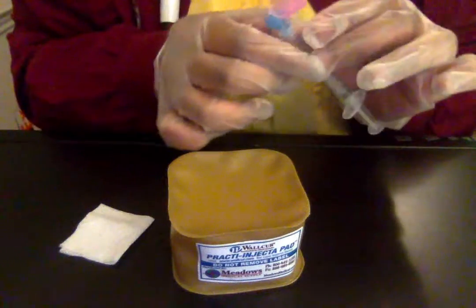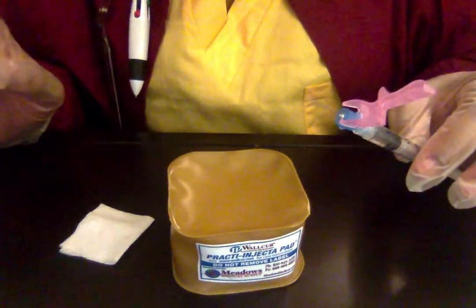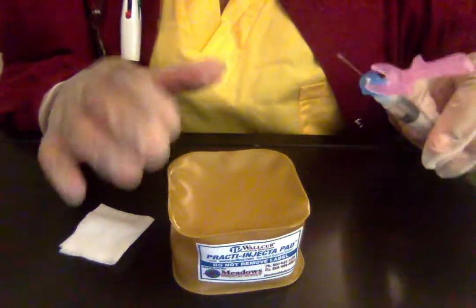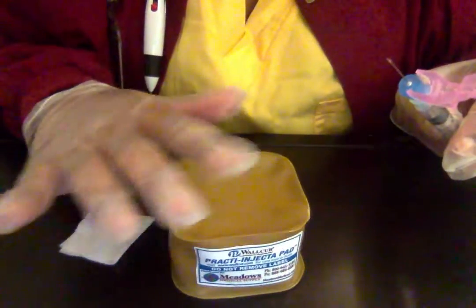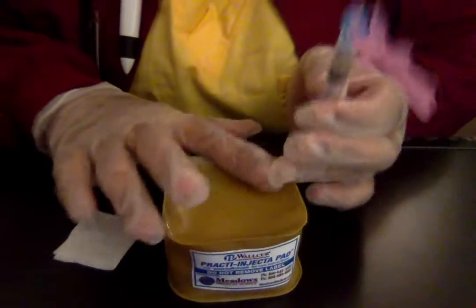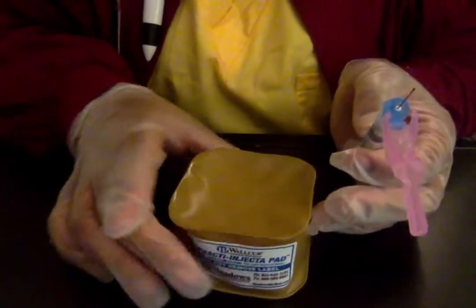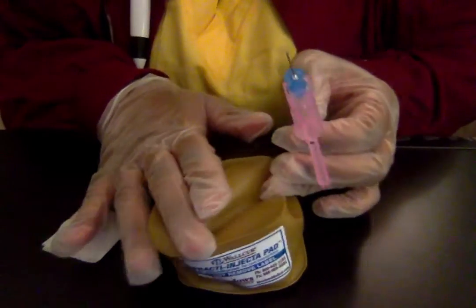And also today we're going to be doing a different method of insertion for our IM. We're going to do a Z-track. With the Z-track, I'm going to make sure that I'm pulling taut and pushing that layer of skin out of the way. So I would move this over so that it can get me closer to that muscle. But since I have such a small space, I can't Z-track and have enough room to do the needle.